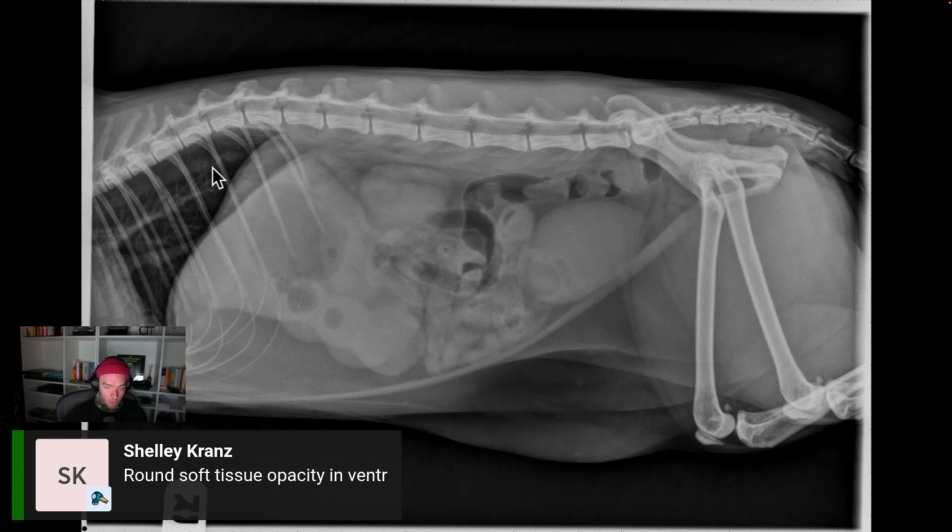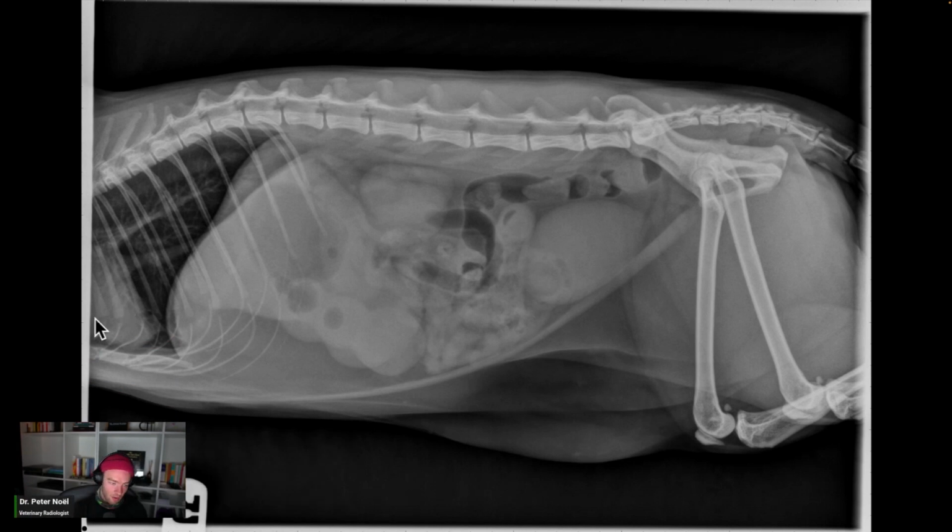Okay, so caudal thorax. I look at the caudal thorax. This is the aorta. That's the caudal vena cava. These are pulmonary blood vessels. Cats, not as often, you're going to see pneumonia. You can see pleural fluid. You can see cardiomegaly, pulmonary mets. So look at that caudal thorax. Here's the liver. Liver's right here. It's fine. Big old falciform fat, well fleshed.